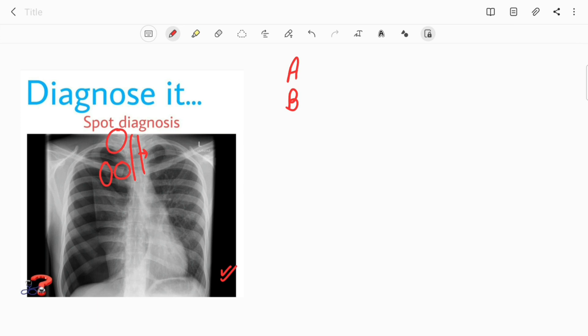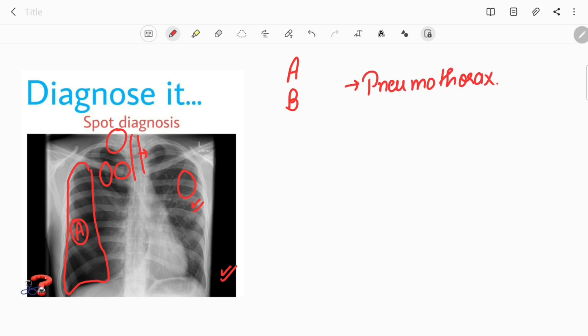Next, discussing the bronchial markings and the lung. In this area, you can see the normal bronchial markings showing the presence of lung. But in this outer area that I am outlining, it is looking more black compared to the rest, and there are no bronchovascular markings. This shows there is air at this place — the presence of air in the thorax, between the visceral and parietal layers of pleura — this is called pneumothorax.